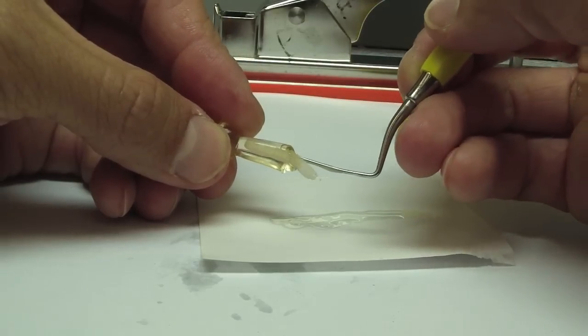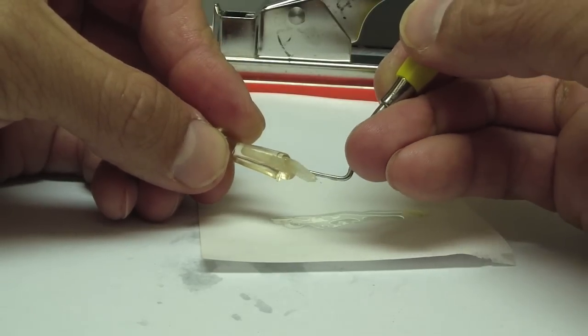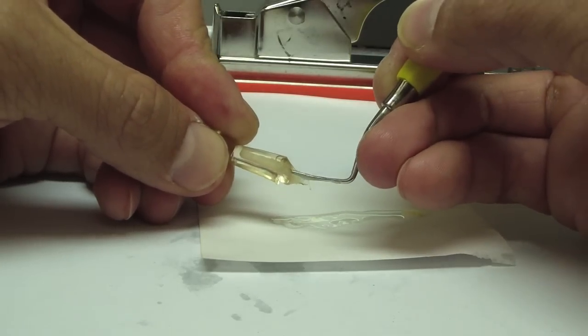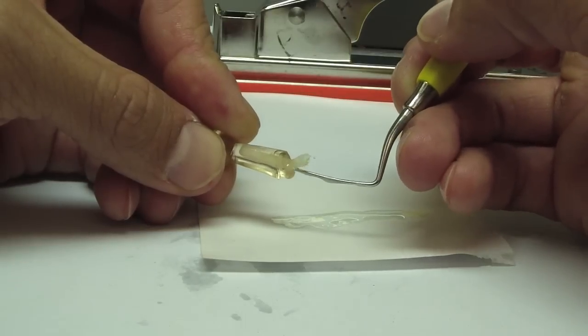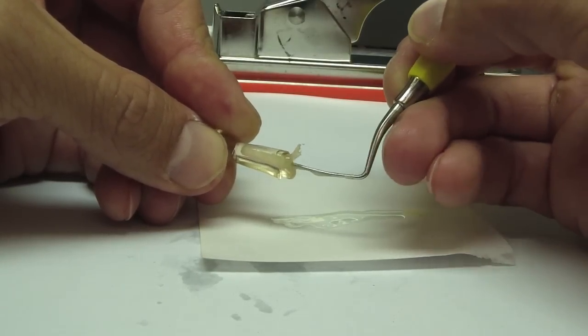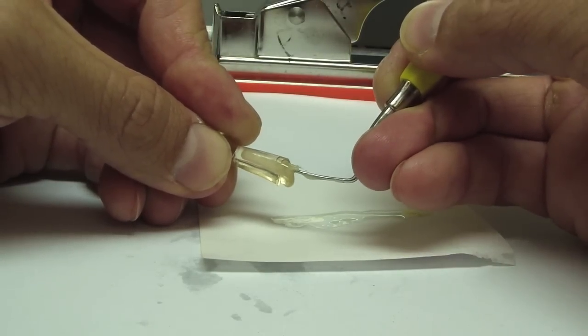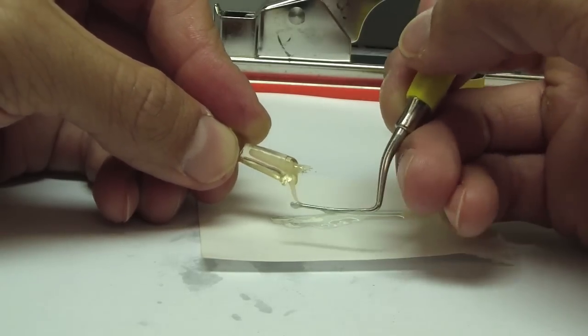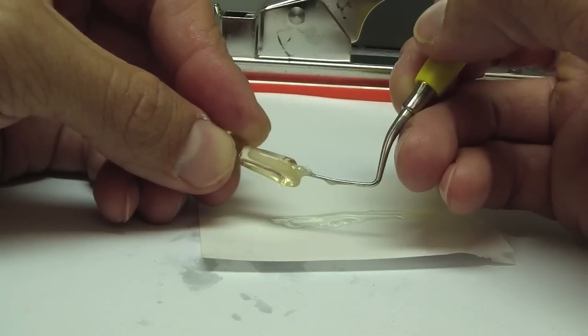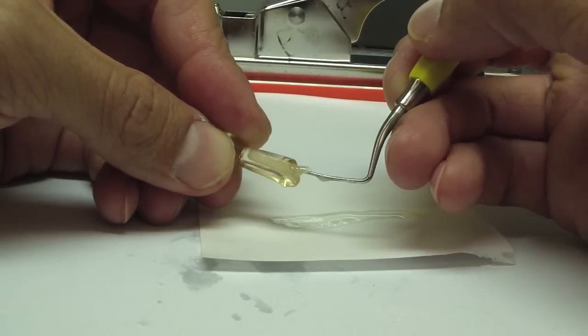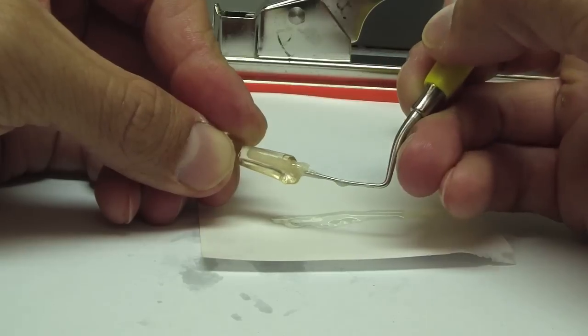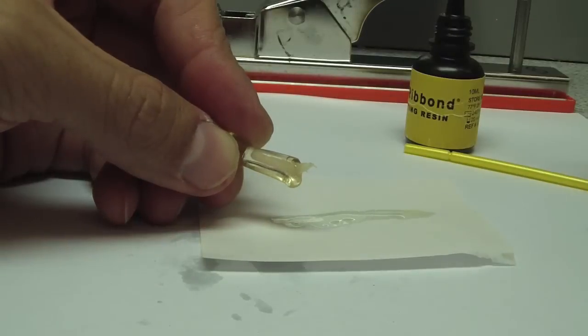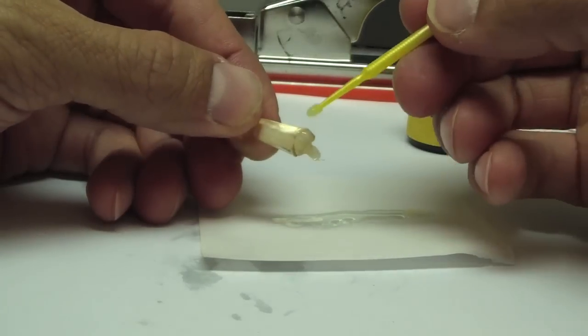At this point I would take the second strand that I mentioned and place that between the two, in an effort to not only increase the density of rib-on but also increase the number of tags. We'd have another tag on the coronal portion which would help decrease the flexibility of the core structure which is bonded to the post. The idea is to have a monoblock structure.